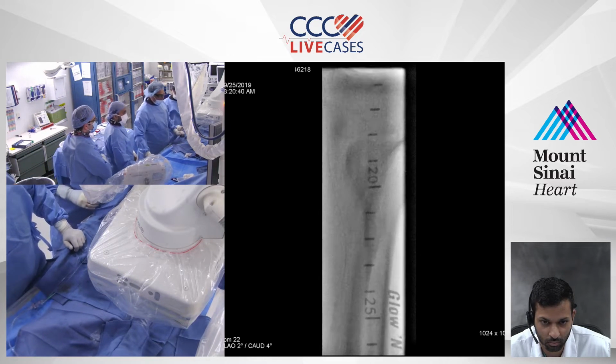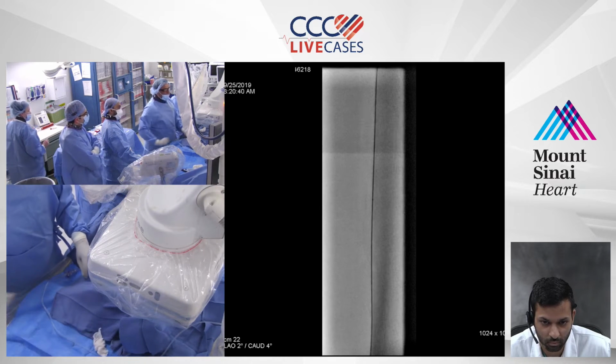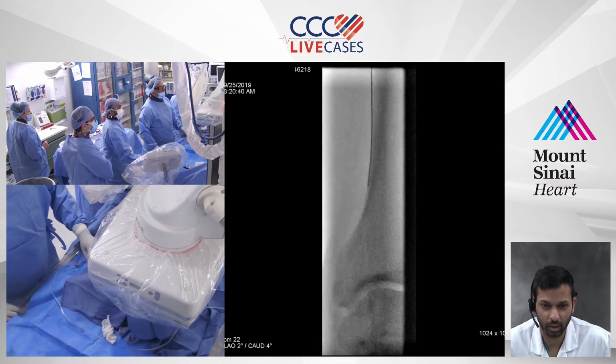That's my question, because I think a lot, and also the location where you get pedal access is very, very important. One second, Ray. Sure. So tell me, go ahead.